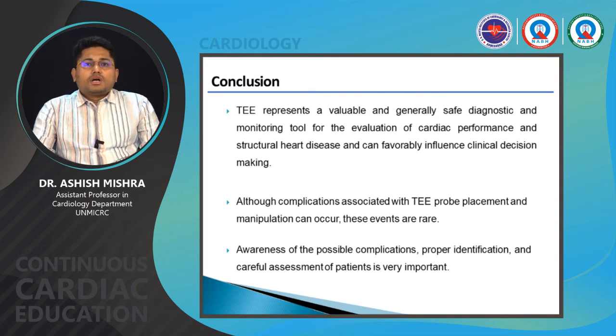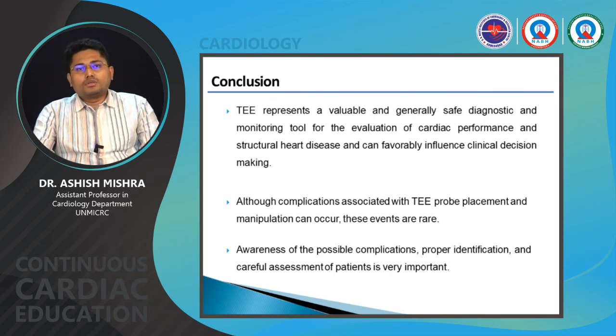So, the concluding remarks: transesophageal echo represents a valuable and generally safe diagnostic and monitoring tool for the evaluation of cardiac performance and structural heart disease, and can favorably influence clinical decision making. Although complications associated with TE probe placement and manipulation can occur, these events are rare. Awareness of the possible complications, proper identification, and careful assessment of the patient are very important.